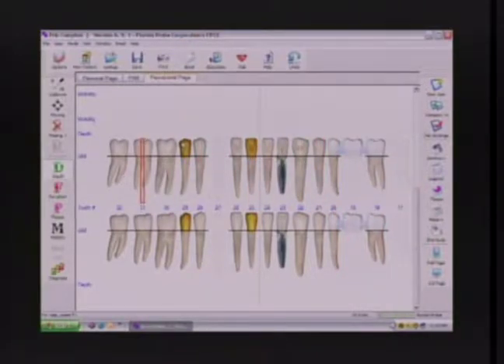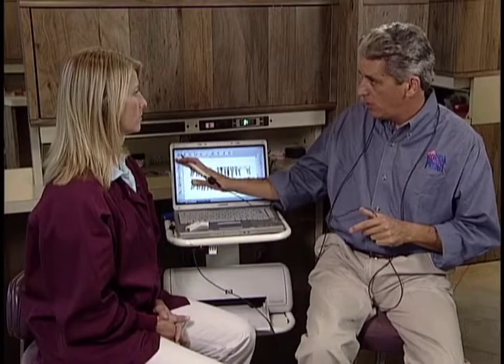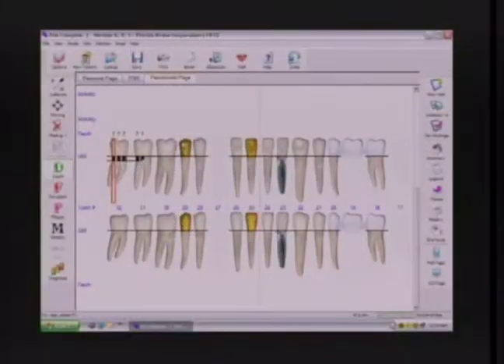Remember I said at the end of each mode, I pause. It's a good time to rinse, suction, let the patient close their jaw, and do a quick review. Am I confident that I've recorded pocket depth correctly? If I am, I advance.